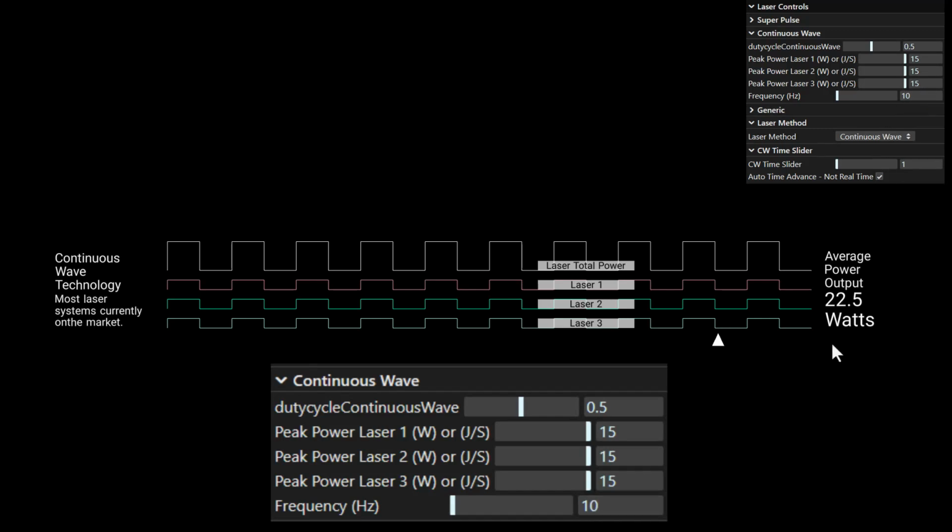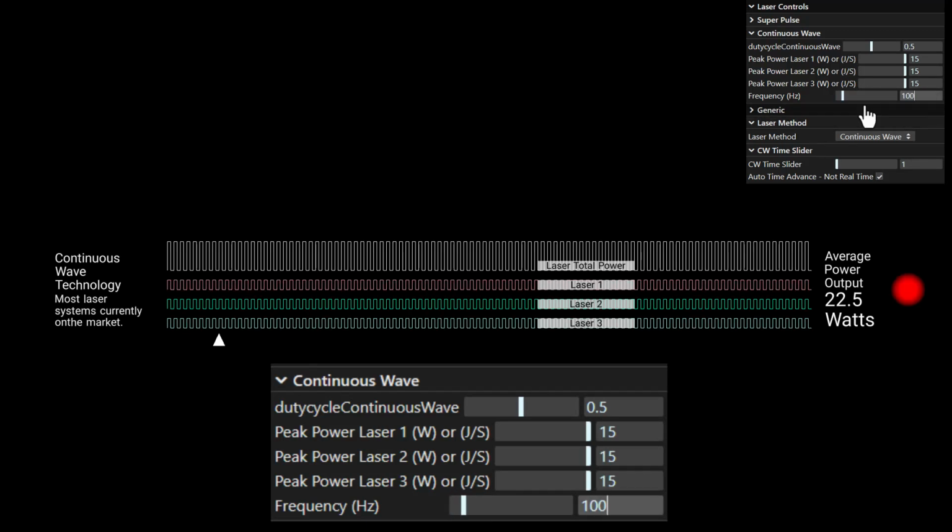Now, this is not real time. All of what you just saw should have happened within a second. But if I take this to, say, 100, it's on and off much faster. But my second here is actually lasting more like 6-10 seconds. I haven't counted it out. But in real time, you can't see much past 50 hertz in terms of on-off times. In fact, coming out of the wall outlets of your house, it's usually running 60 hertz. If you're over in Europe and overseas, it's oftentimes 50 hertz. You don't see lights flickering if the frequency is higher than 50 or 60.